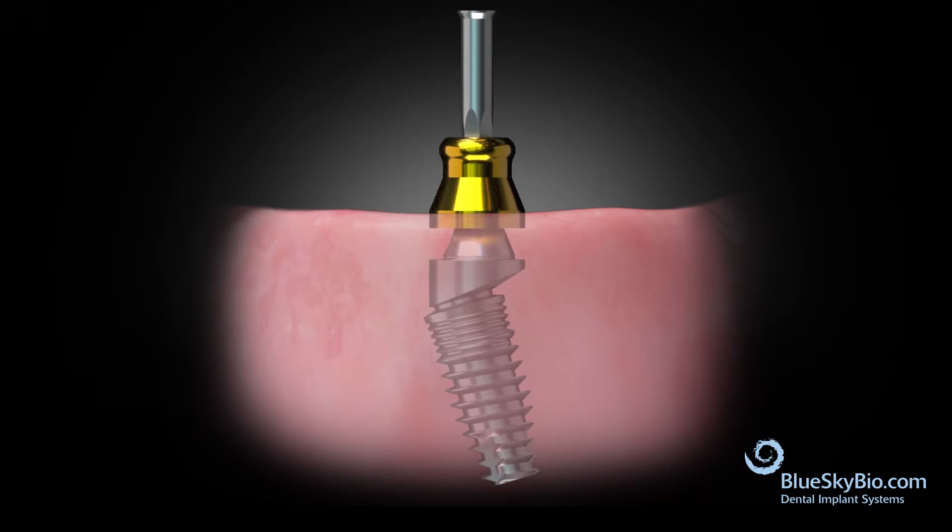Use the hex driver to place the male over denture component onto the top of the multi-unit abutment and torque it to 15 N·cm.